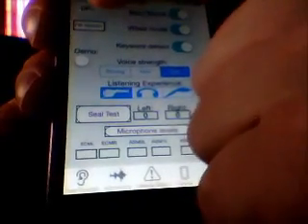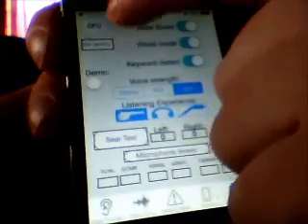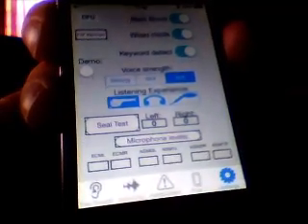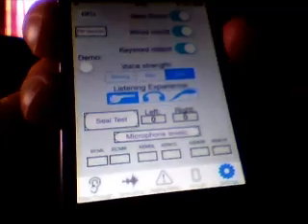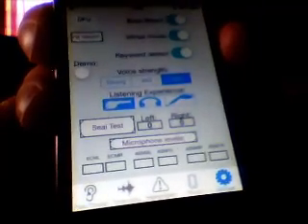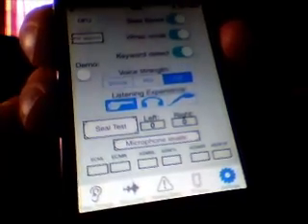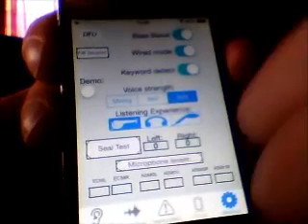This DFU button here at the top, when you press that, it sends a BTLE command to enter the earphone hardware system into a device firmware update mode, which can update the firmware of the earphone hardware.